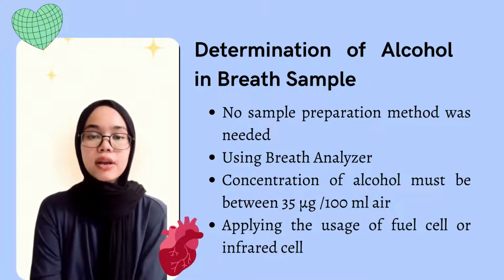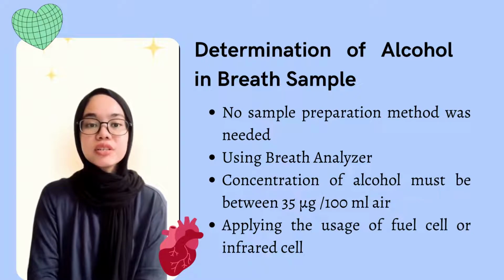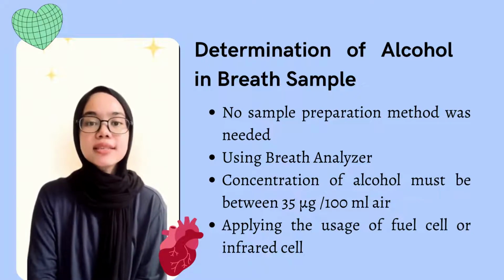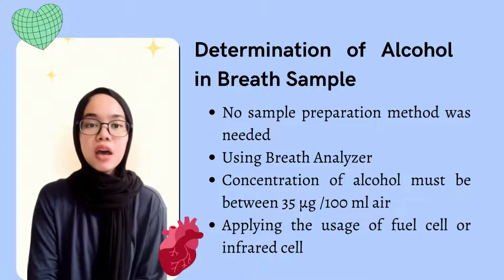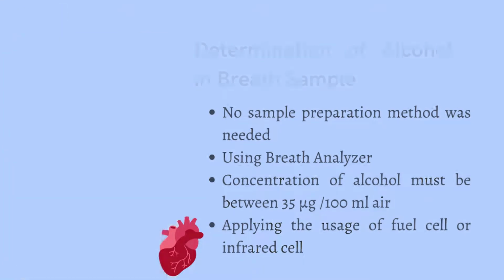Infrared radiation is directly passed through the sample using an infrared cell, and any unabsorbed energy on the opposite side is measured. As expiration continues, the concentration of alcohol rises, and the breath sample is analyzed once the ethanol level has stabilized. This enables precise alcohol readings and implies that the amount of air required depends on the size of the person's lungs. The accuracy of the sample testing totally depends on the breath from the deep lung air.